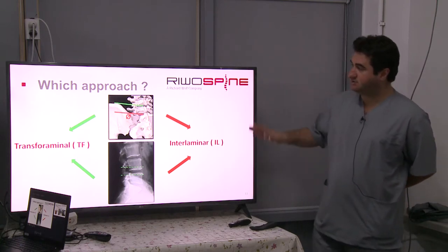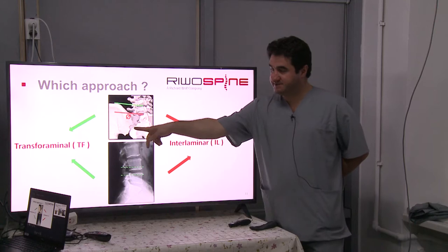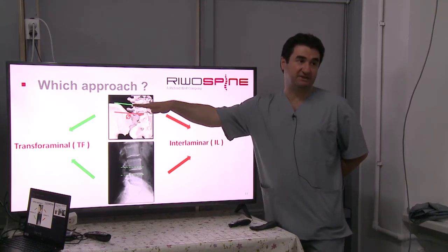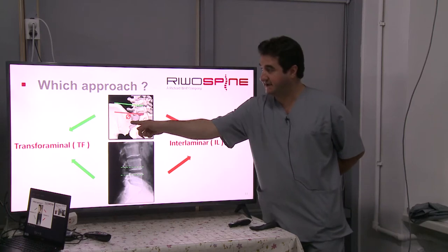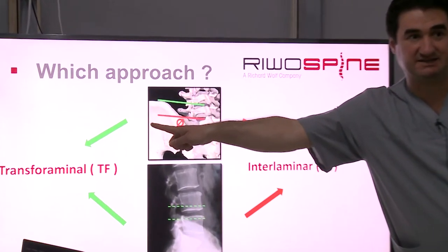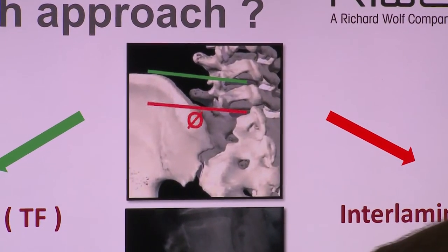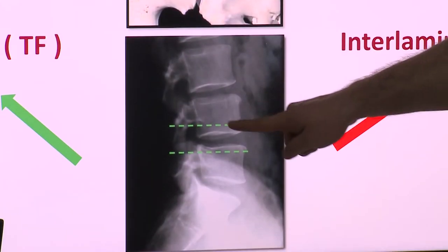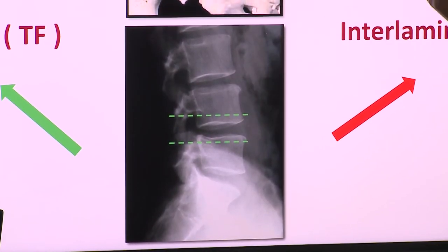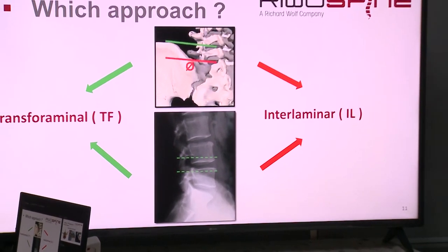To select, according to us, if you want to do a transforaminal approach, the foramen has to be free from the lateral side. If there is an iliac crest on the way to the foramen, we don't prefer to do it transforaminally, we prefer to do it interlaminar. Also, if the fragment is over this line or lower than this line, then again we prefer the interlaminar approach. These are the basic main criteria for us.